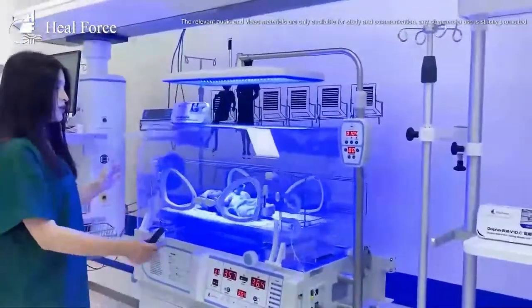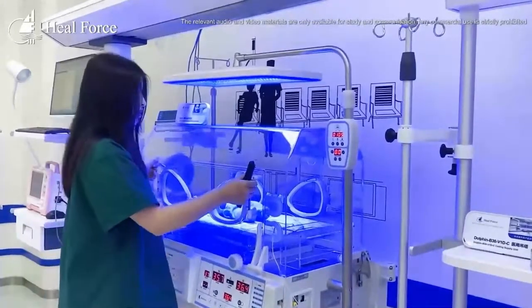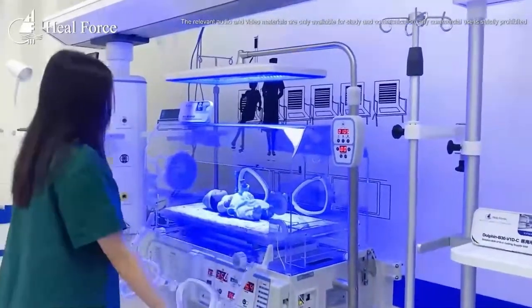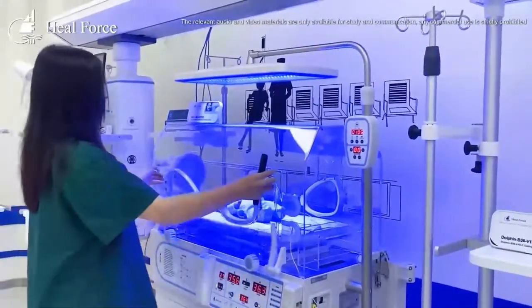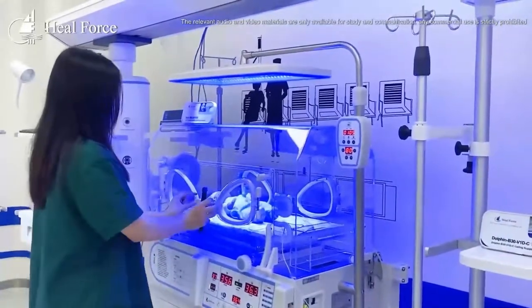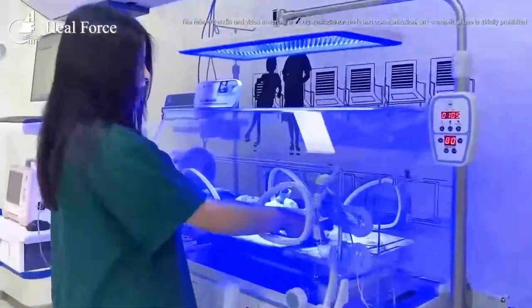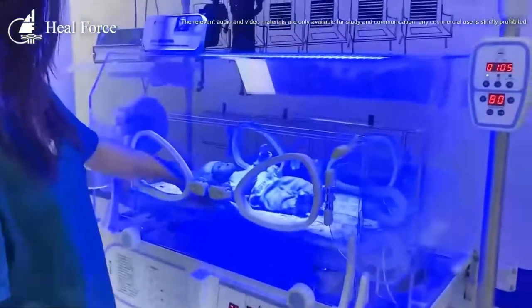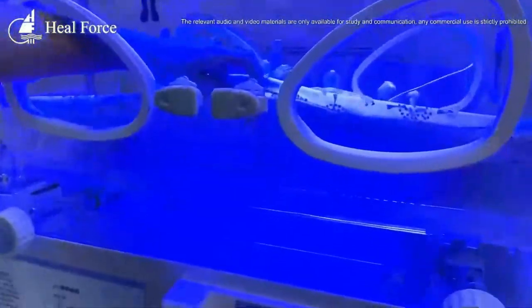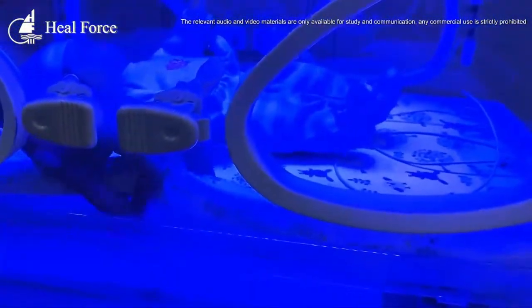Coming to the incubator hood, we designed the wall so it can be put down and up to place the baby in or out. We also designed multiple operation holes so nurses can take care of the baby from different directions. Inside the incubator, there is an optional mattress, and you can also fit an X-ray cassette or even a baby scale inside.